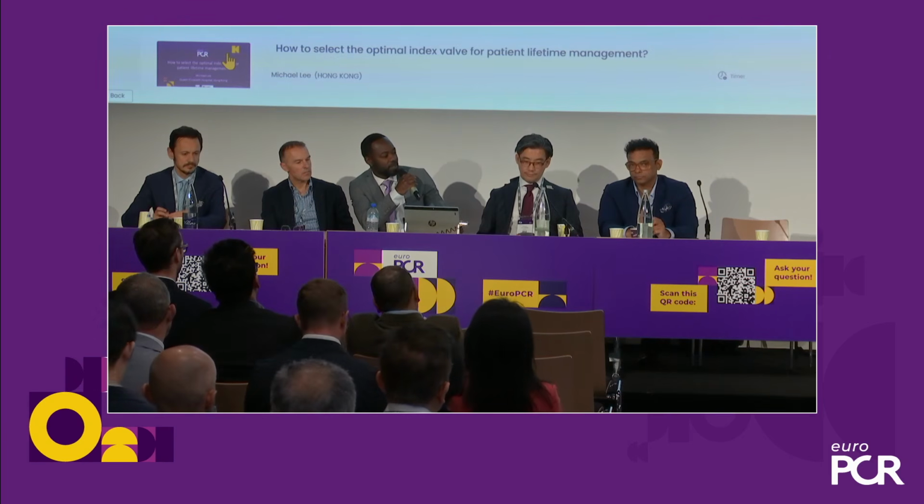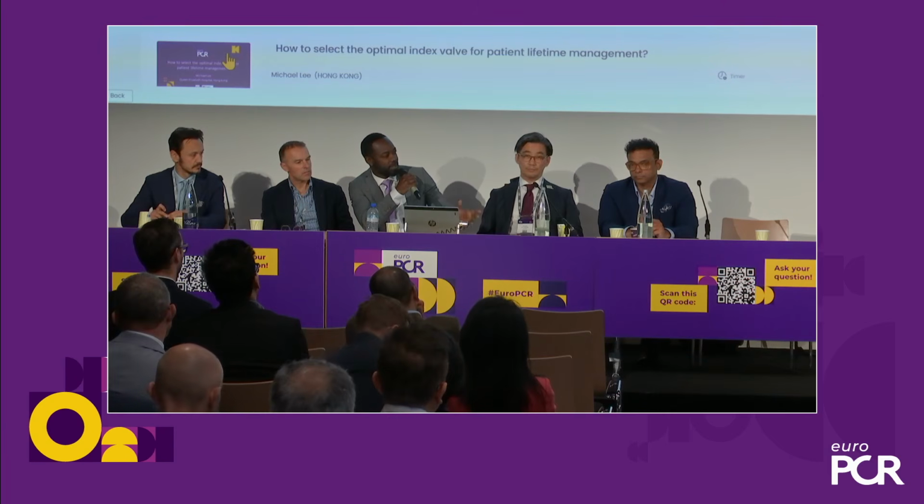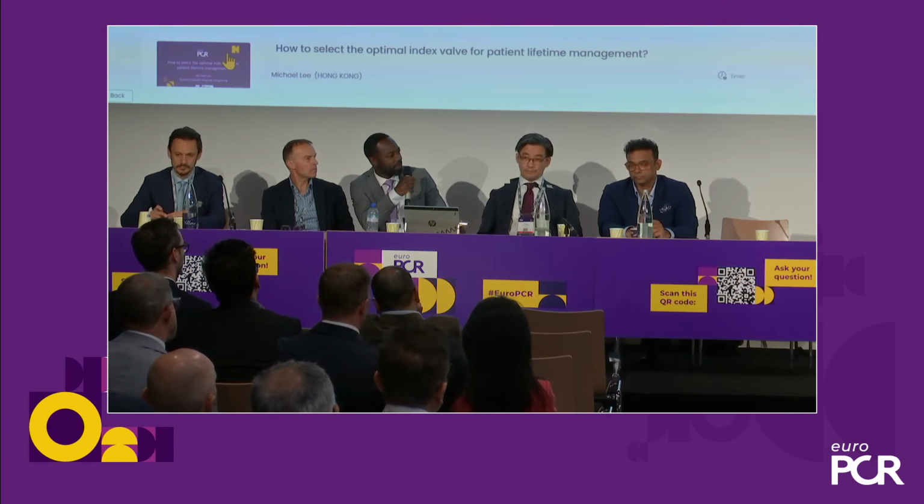Do you think that it has something to do with the commissural alignment at that time? How do you explain that? Oh, I think because for a lower frame balloon expandable device, you don't really need to do commissural alignment, although some people will do it for those as well, because it's less important. But for taller self-expanding valves, commissural alignment actually impacts a lot on the future coronary access. I think if we run another trial aiming at perfect commissural alignment, then the Navitor valve probably will have a similar coronary reaccess rate as compared to the balloon expandable valve.